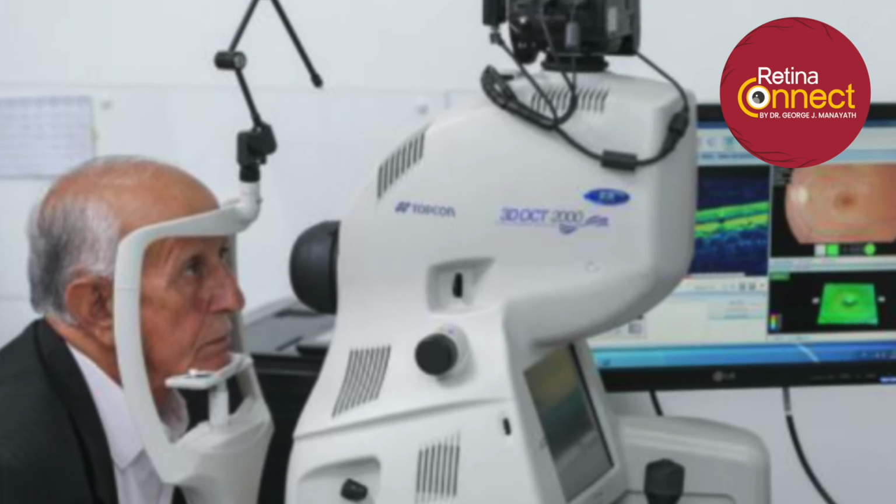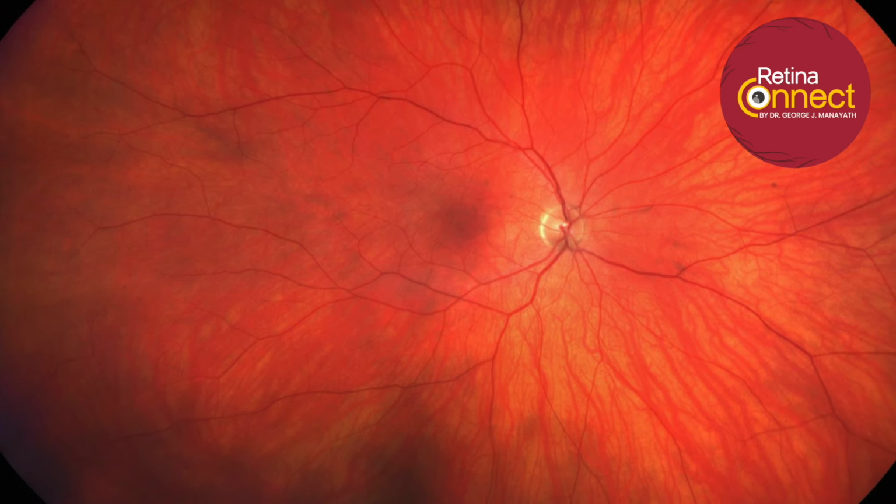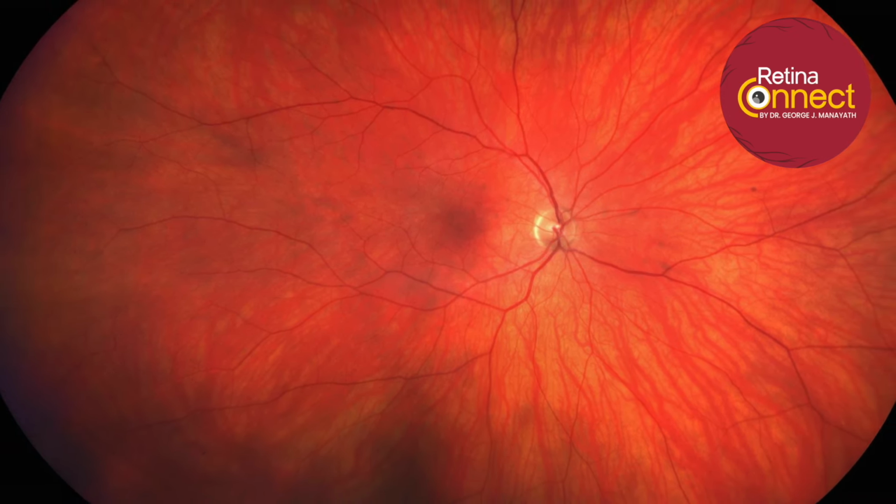of the centers. Another test that is very simple and can be repeated without any side effect or discomfort to the eye is something called fundus photograph or the retinal photograph, which is a digital photo of the retina which shows any hemorrhages or any other findings, helping the specialist to precisely see what stage of retinopathy it is, whether it's early or late, and then give the appropriate treatments. So these are very simple tests and may need to be repeated during the follow-up visits as well to compare to the previous for a documentation also.